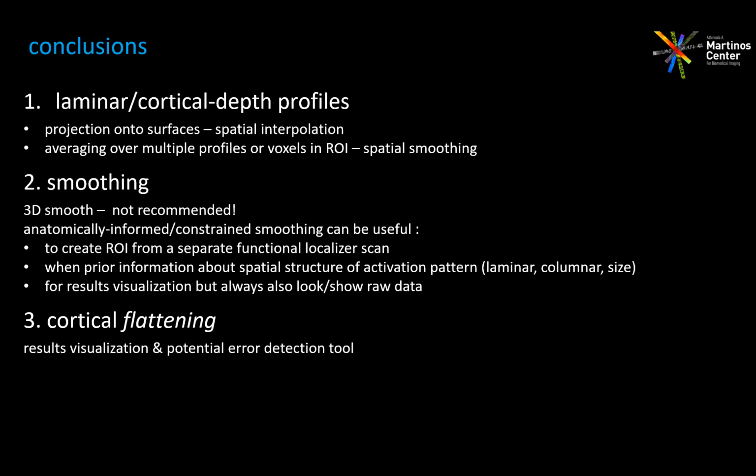And cortical flattening, as you saw, is a great visualization tool, but it can also be useful for debugging. I think Daniel might have mentioned that yesterday. If you are looking at segmentation errors or meshing errors, it's much easier to see them in the inflated version. So it might be helpful for validation at different stages of generating our results as well.